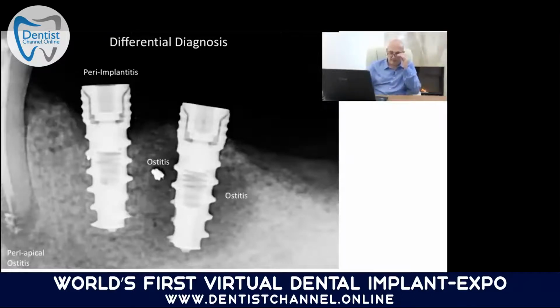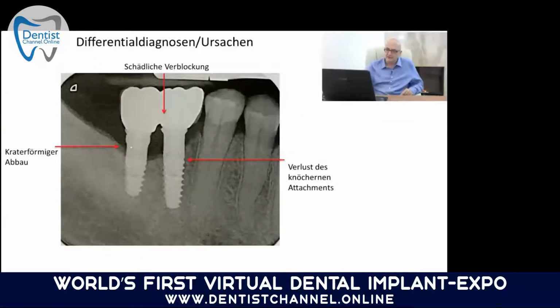As you see here, there is a periapical ostitis. Also here around this root canal treated tooth, you see overpressed root canal filling material, and you see an infection. Also here the bone has a lower mineralization. In the case of periimplantitis, the mineralization around here towards the apex of the implant is quite high. So there is no infection, but there's only crater-like bone loss. This picture was given to me recently.